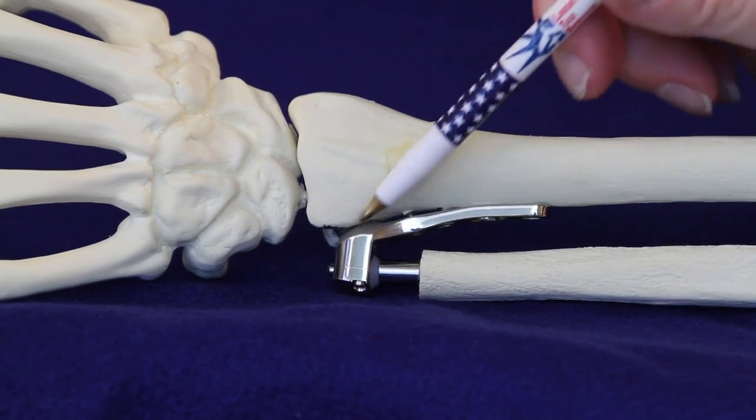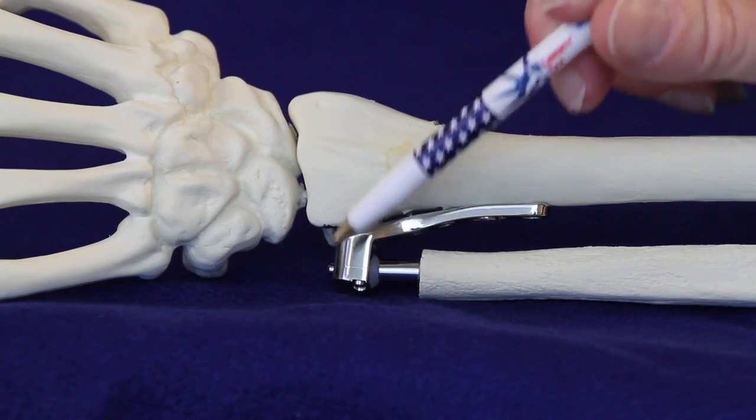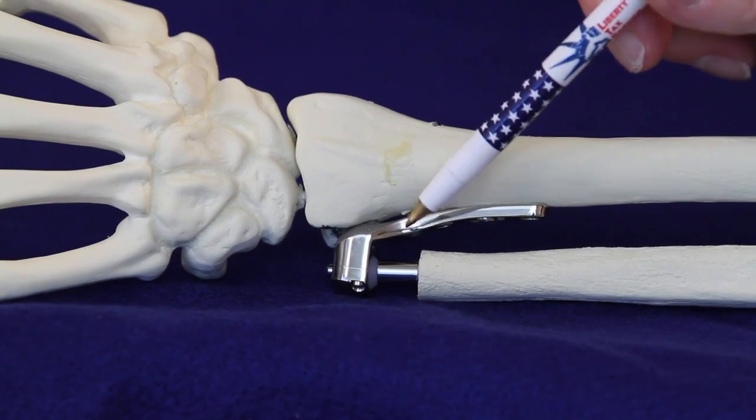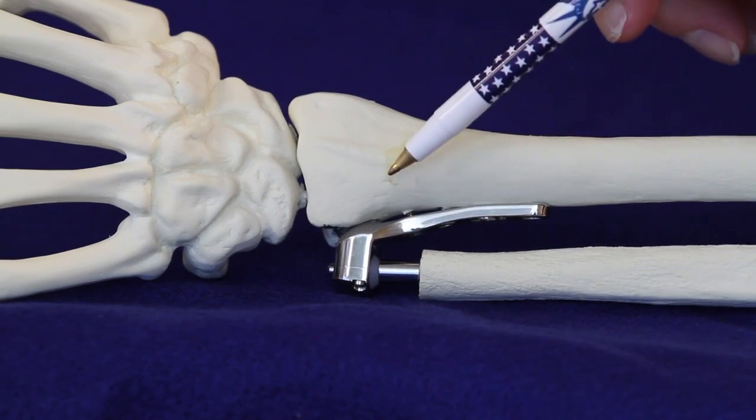Replacements of the past consisted of removal of the distal ulna alone with replacement, or unipolar replacements. But this produced metal-on-bone articulation which was often painful.